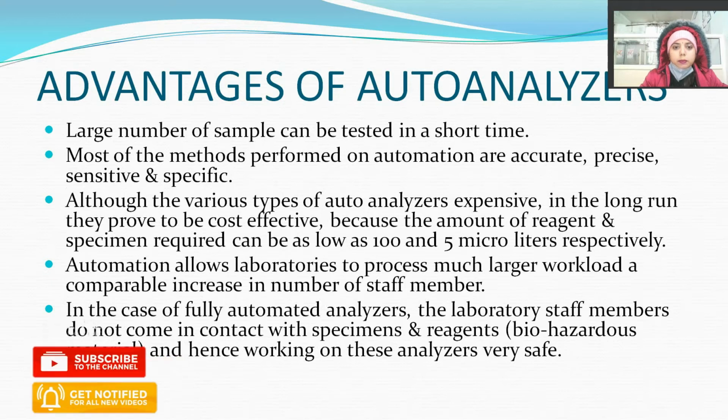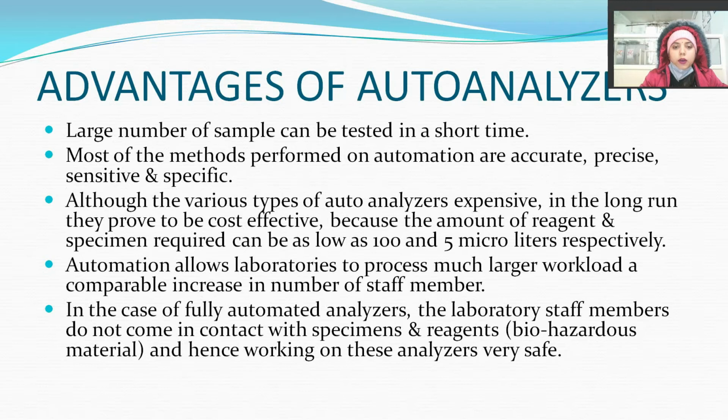Large number of samples can be tested in a short time. Most of the methods performed on automation are accurate and precise, sensitive and specific. Then, although the various types of auto analyzers are expensive, in the long run they prove to be cost effective because the amount of reagent and specimen required can be as low as 100 and 5 microliters respectively.